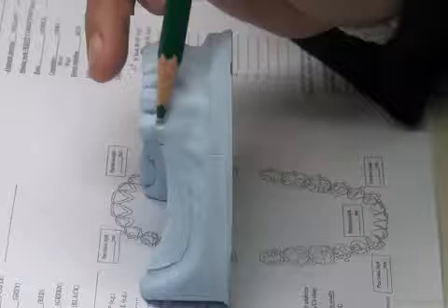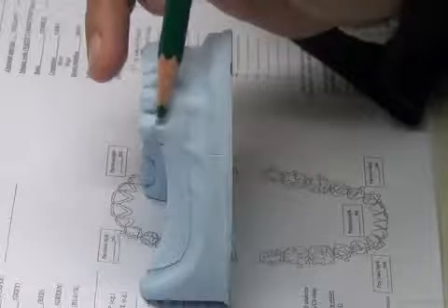So the first thing is its relation with the survey line occlusally. Okay, let's try to find a clasp. Say this undercut, for example. Its relation with the survey line occlusally: it's below it, in the suitable undercut, the measured undercut. Not any undercut. I have to measure it using the undercut gauge.